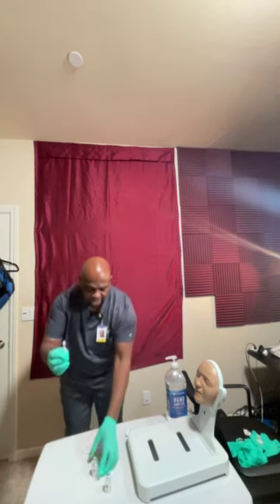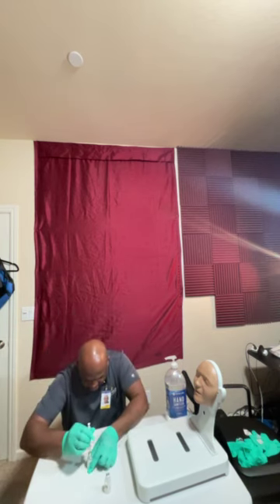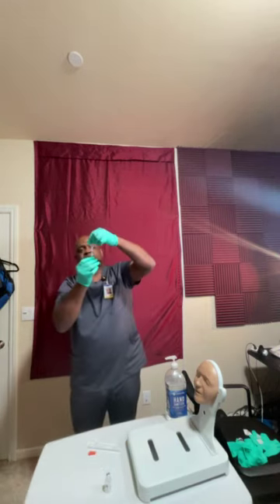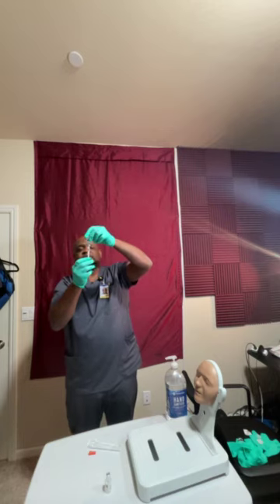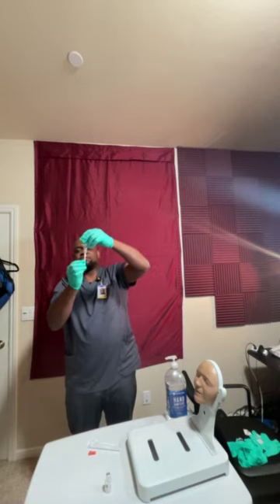Okay, from there, I'll take the NPH. Let me put this down on the table. And with the NPH, I want to make sure that I'm not pressing down on the plunger. Now I'm going to invert the NPH. Now I'm going to be pulling out 8 units of the NPH, the intermediate one. 8 units. Just pull that down. Let me make sure I'm on my numbers. 8 units. Good.